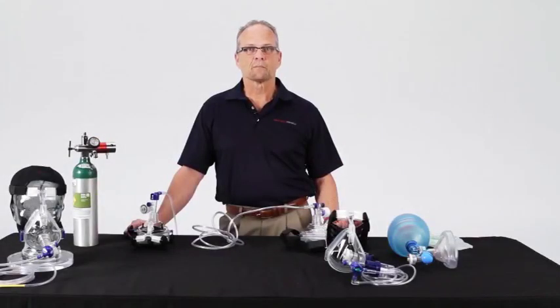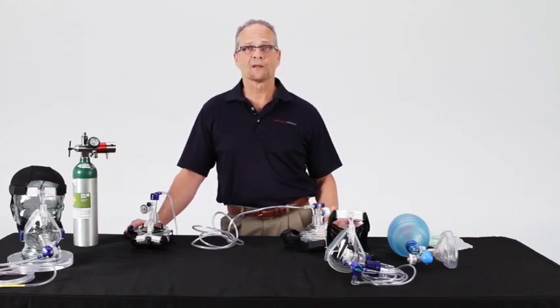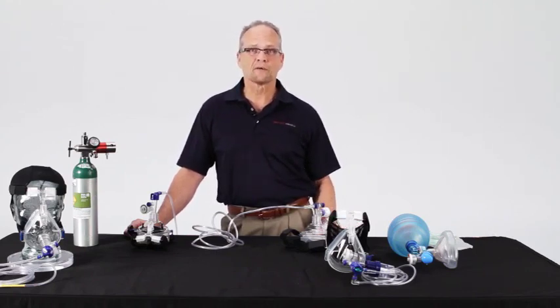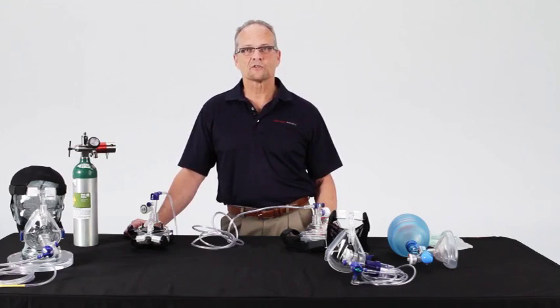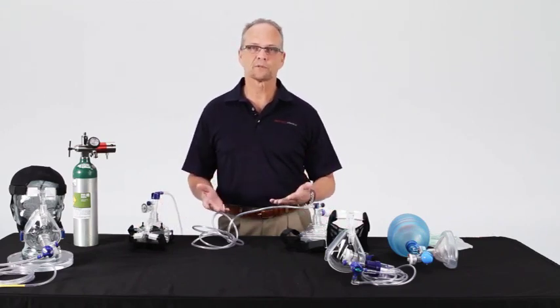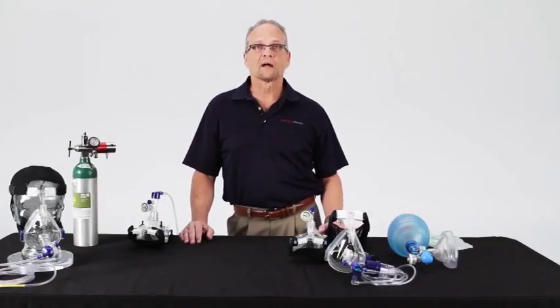When applying CPAP, probably the worst technique is to strap the device on someone's face without some explanation or coaching. I've seen clinicians start the process out by saying to patients, "You're not going to like this," or just start strapping the device on. In either case, it's a bad way to start. Remember that patients who are CPAP candidates are in distress, not in failure, so you have some time to set up and explain the procedure. Most patients like to be in charge, or at least feel like they have some say in what's going on.